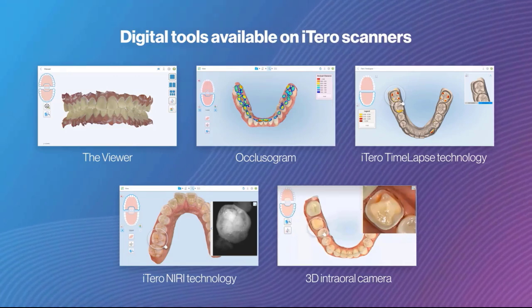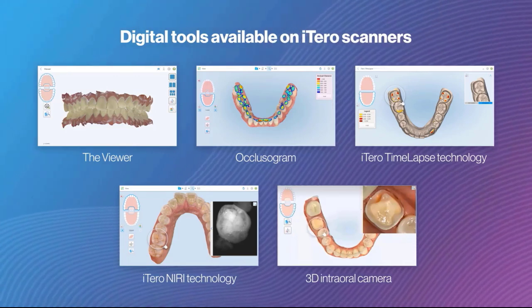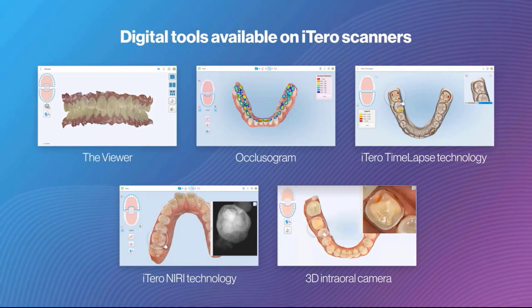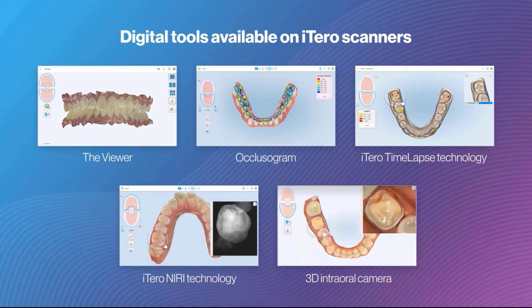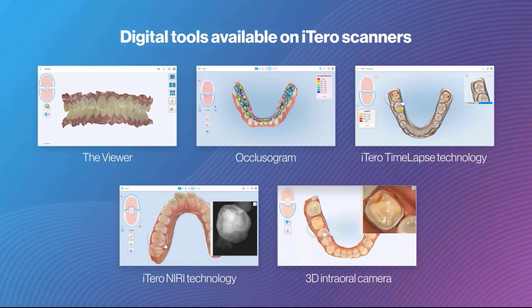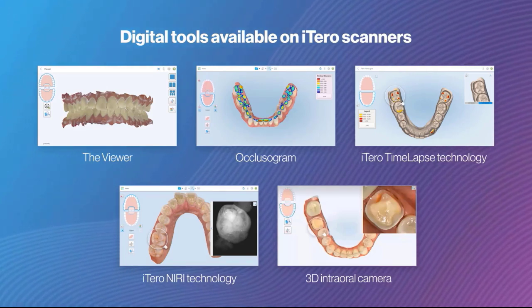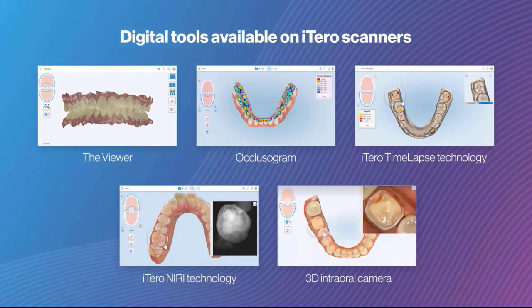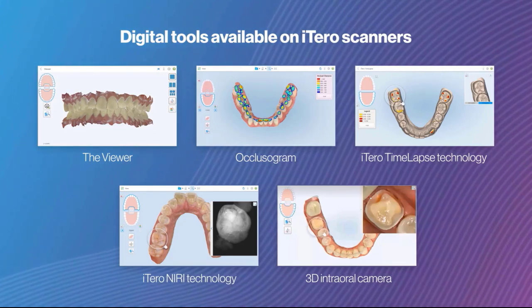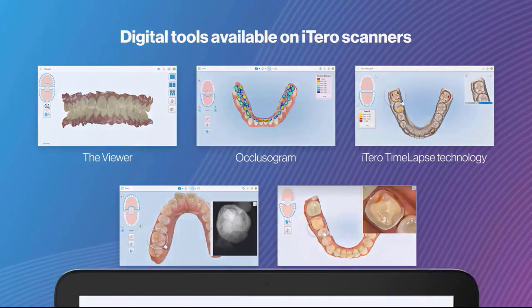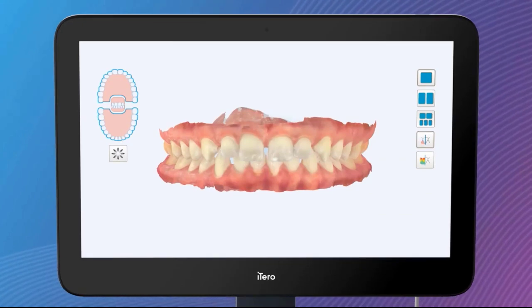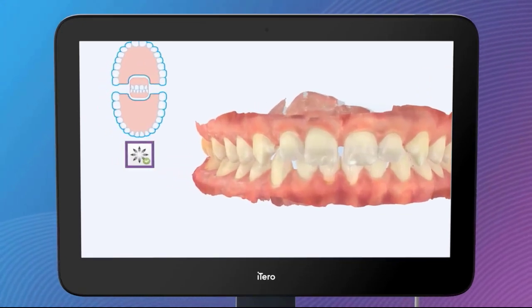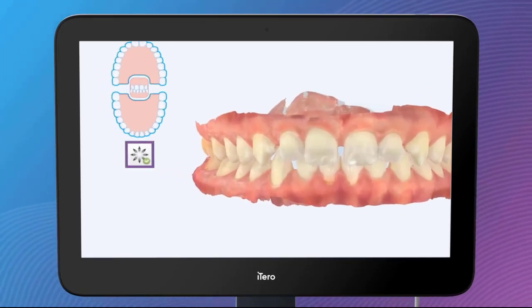These tools can help guide an oral health assessment conversation with your patients that supports the need and benefits of an Invisalign treatment. You can also go to the Patients or Orders list and work on another scan. When the simulation is ready, a green checkmark will appear on the button. Tap on it to open the simulator.